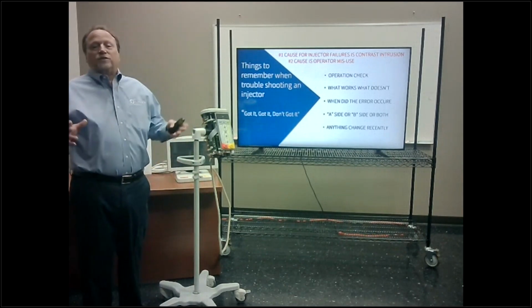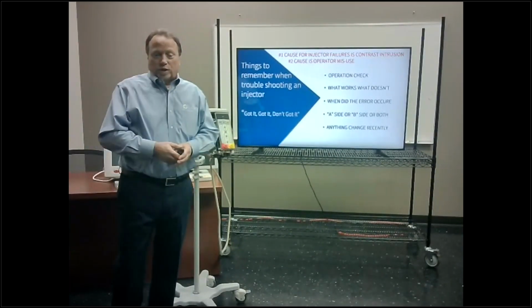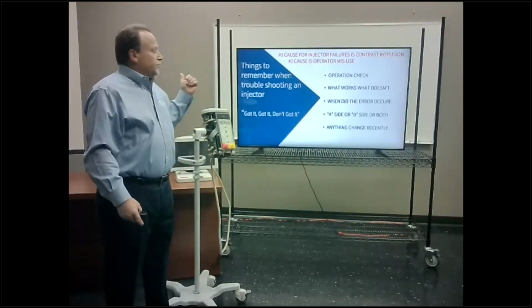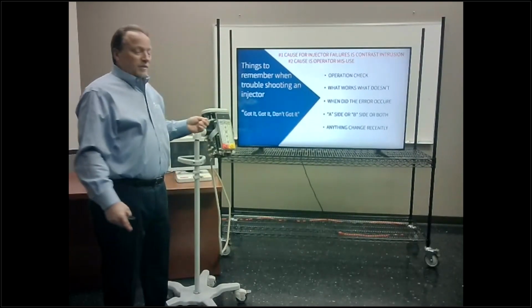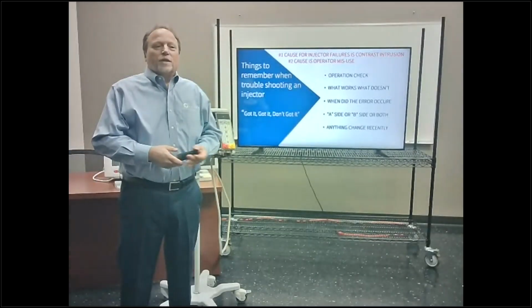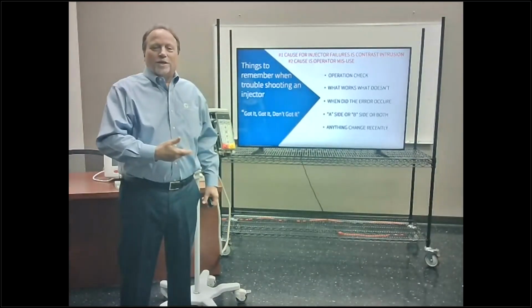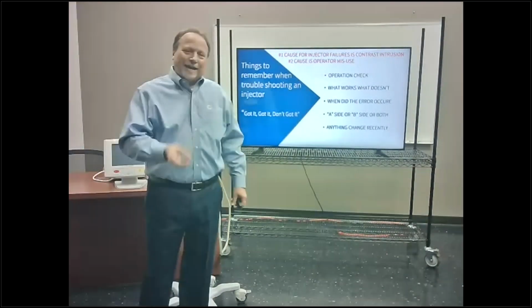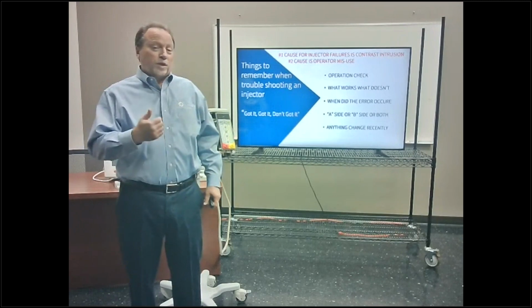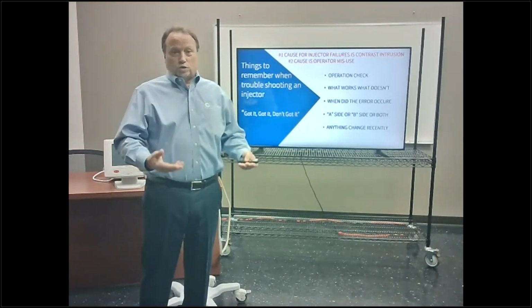We're going to start off with some basic troubleshooting guidelines, or actually any troubleshooting, but this is geared towards the injectors. Things to remember while troubleshooting an injector. I was taught in the U.S. Army back just a few years ago, '92, that when you're troubleshooting, you have to start with something. So what they always told us was, got it, don't got it. When you don't got it, go back to where you got it. And somewhere between got it and don't got it is your problem. And that's where you narrow your troubleshooting down to.